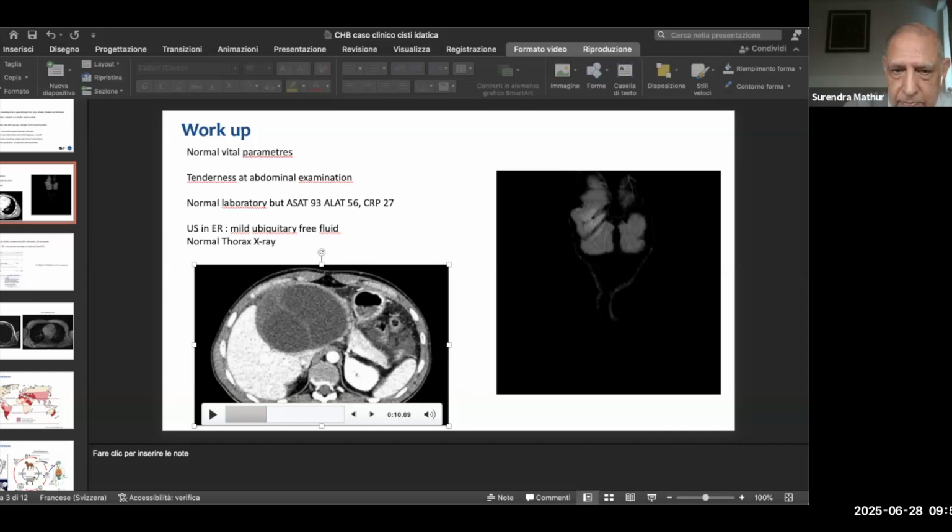So when we do it laparoscopically, you go inside and keep on puncturing each and every daughter cyst, suck away the contents, inject the scolicidal agent. Now, coming to the injection of the scolicidal agent, if there is a biliary communication suspected in a hydatid cyst, it is a contraindication to use the scolicidal agent inside the cyst, because any scolicidal agent can cause sclerosis of the bile duct itself. Okay, so that's the one caveat for injection.